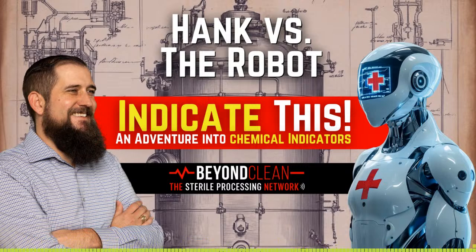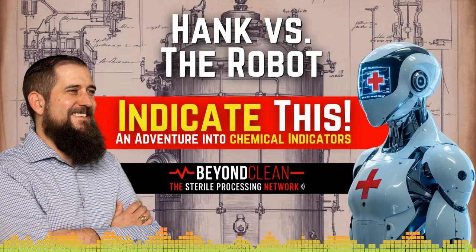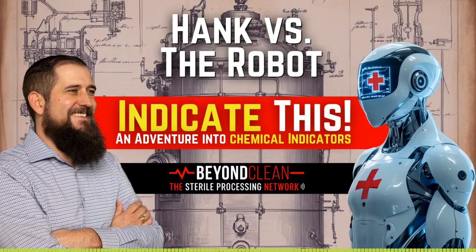Glad you like the analogy, Hank. Feel free to borrow it anytime. When it comes to manufacturing chemical indicators and integrators, the process is a mix of high-tech science and precision engineering. These sterility assurance products are built to be reliable, reproducible, and compliant with strict regulatory standards. Let's break it down. The foundation. Both chemical indicators and integrators start with a substrate, typically a strip of paper, plastic, or foil. This substrate acts as the base for applying the chemical components. It's chosen for durability and compatibility with sterilization processes like steam, ethylene oxide, or hydrogen peroxide.